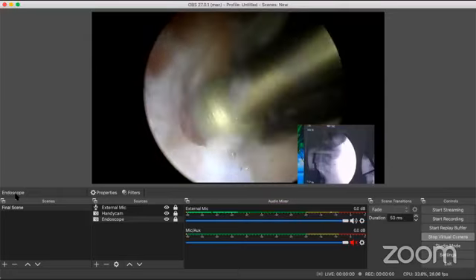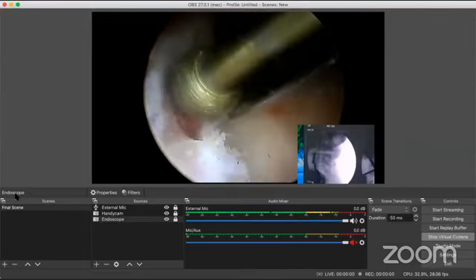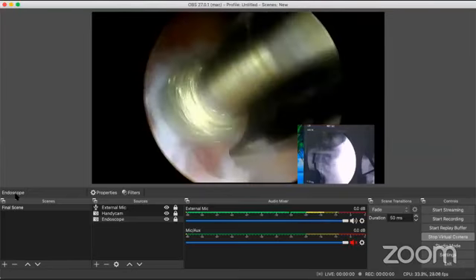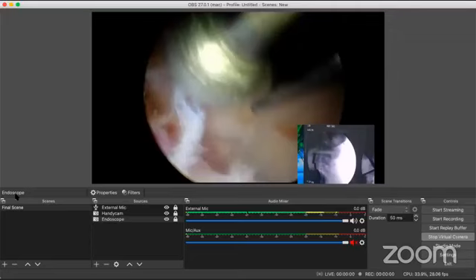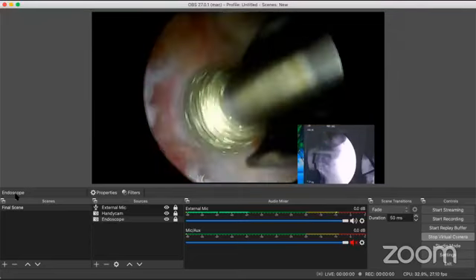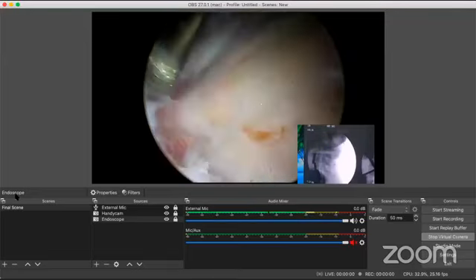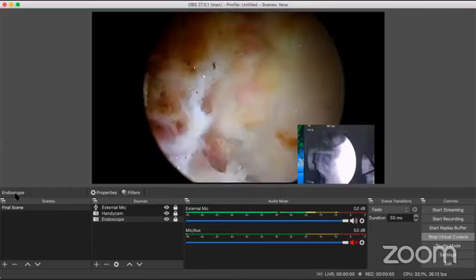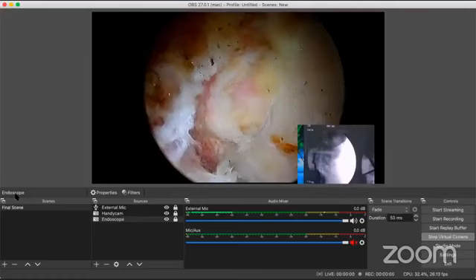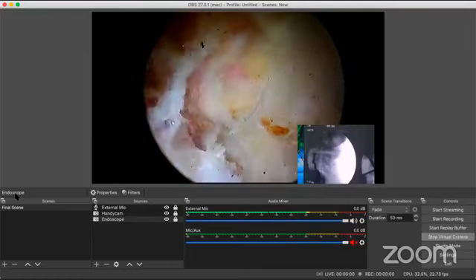So now as I open this up and as I go up medially, I'm going to open towards the V. I'm opening up the V now. And now I'll be opening up the lamina. Now I've already stripped the bone so much, but you can see how much of a tissue cover there is still there. Okay. So you're going to halt 1 minute. And you're again going to use a kerrison punch, a disc punch. And we're going to use our plasma to remove some more tissue from here.